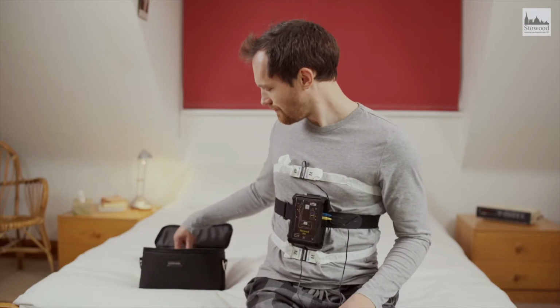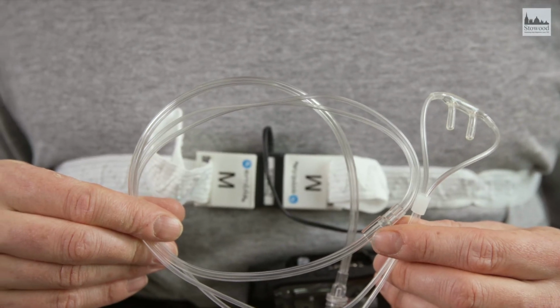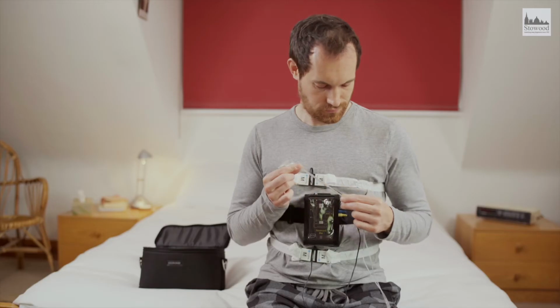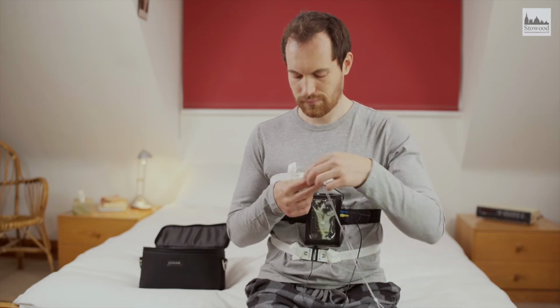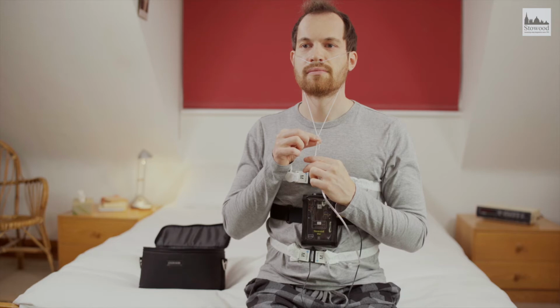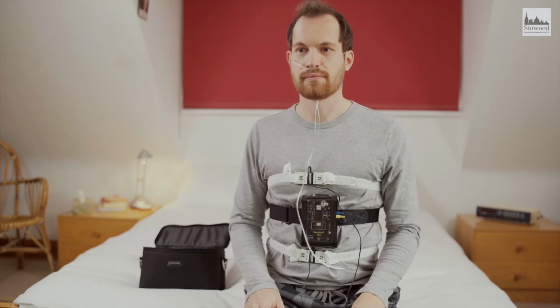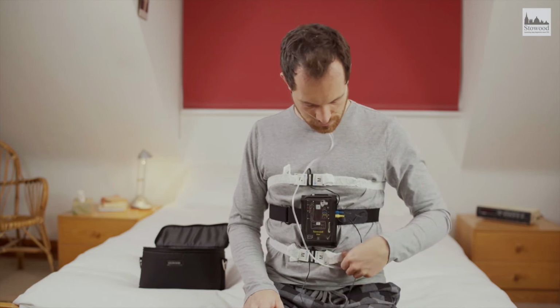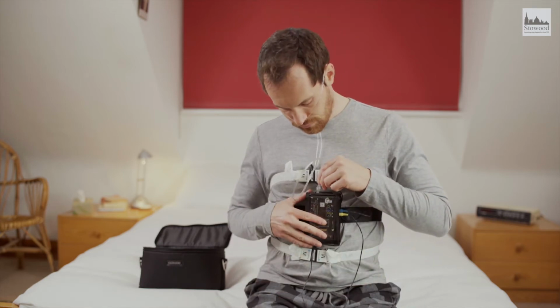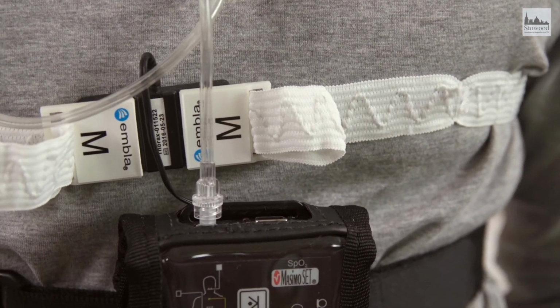Open the sealed bag containing the nasal cannula. Slide the collar down, then place the nasal prongs at the nose entrance. Fit the loop over the ears and then back to the front under the chin. Do not pull it over the head. Slide the collar up to your chin to hold the nasal cannula securely to your head. Then screw the nasal cannula onto the sleep recorder. Don't be tempted to over-tighten, a quarter turn will do.